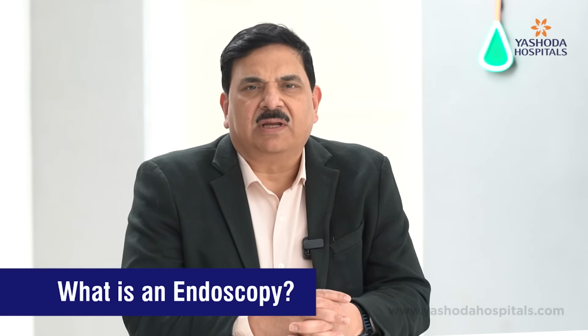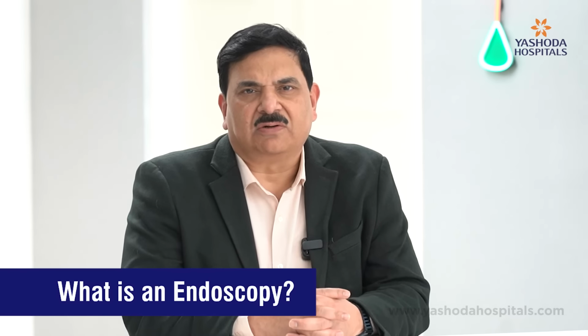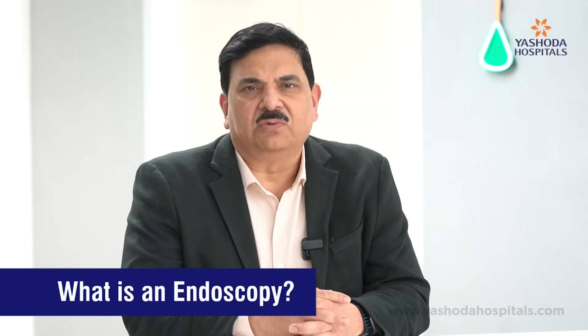So endoscopy is a very common procedure that is done by the gastroenterologist to take a look into the esophagus, stomach and upper part of duodenum.